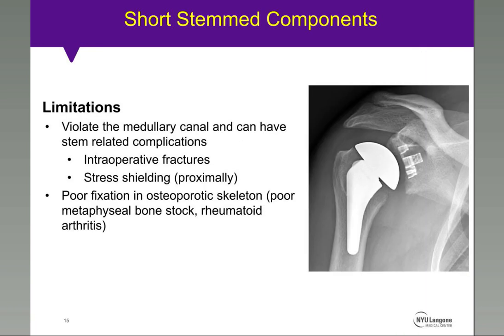However, short stems also have limitations that were associated with the standard stems. They do violate the medullary canal and can have stem-related complications, including intraoperative fractures and proximal stress shielding. In addition, fixation in osteoporotic bones may be compromised due to poor bone stock in the metaphysis.